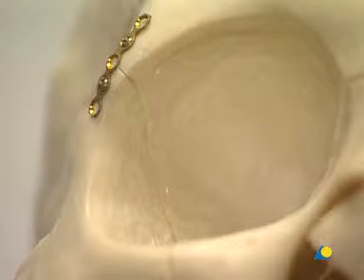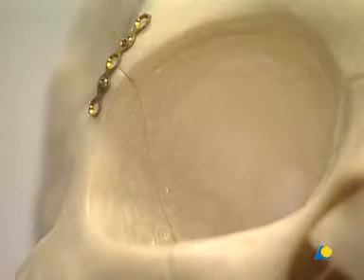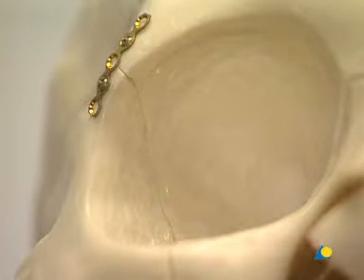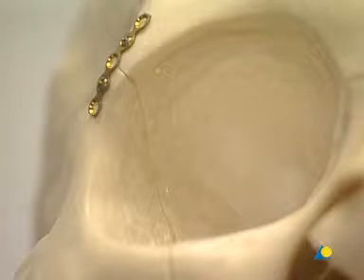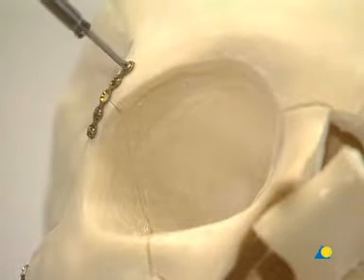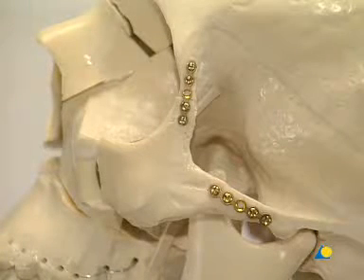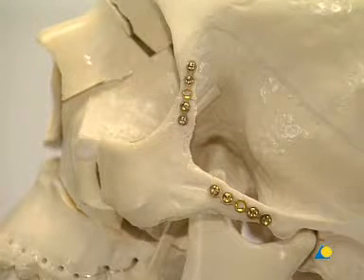Confirmation of the correct three-dimensional reduction of the zygoma is made by an intraorbital examination of the lateral orbital wall. It is important to make sure that there is no step-off between the greater wing of the sphenoid and the zygoma. During reduction of the zygoma, the alignment of the lateral orbital wall should be reconfirmed. If the alignment is correct, the two remaining screws are placed in the first plate. The fixation of the zygomatic complex is then repeated on the opposite side of the face, with a 1.3 plate placed at the zygomatic frontal fracture and a 1.5 plate on the zygomatic arch.